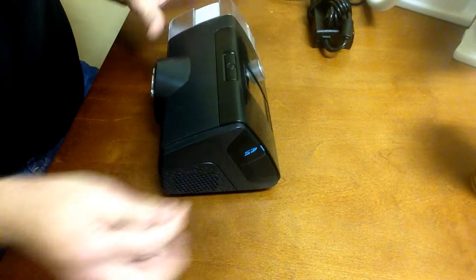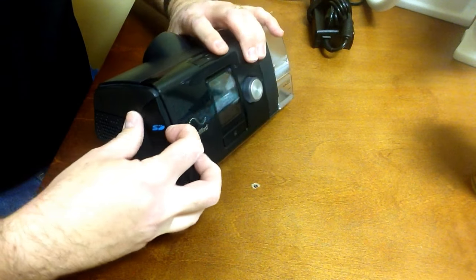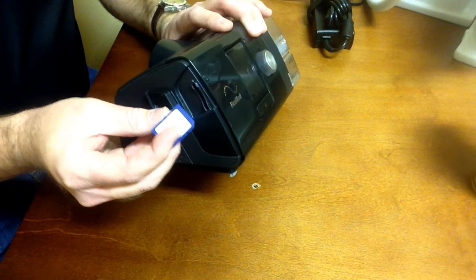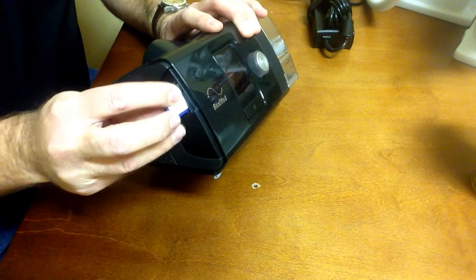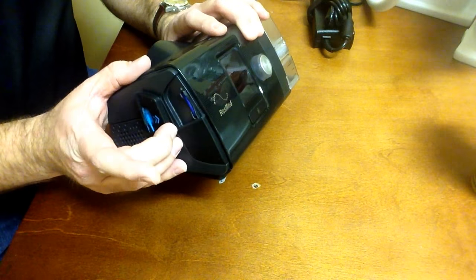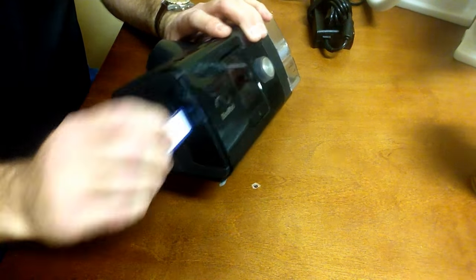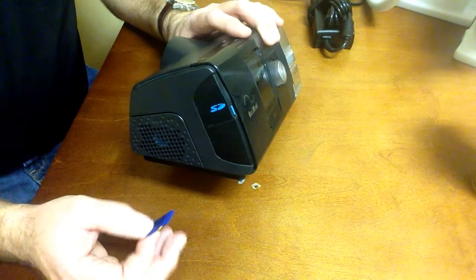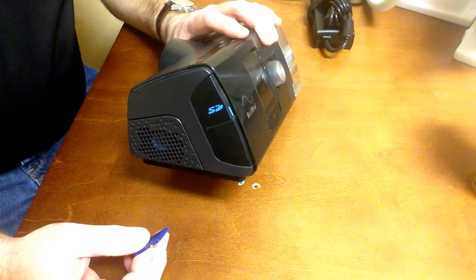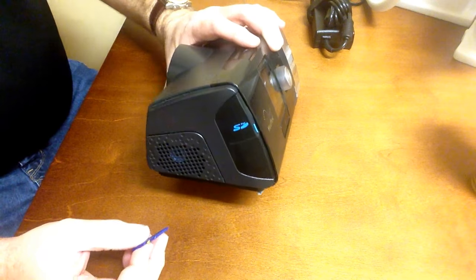The SD card slot, if you have one, is in the end piece — it'll actually say SD, and it opens up. If you're going to put an SD card in, it simply slides in with the label to the front until it clicks into position. To remove it, push in slightly and it'll come out partway. The SD card is not required, but your doctor may ask you to bring it in so they can see how your therapy is going.